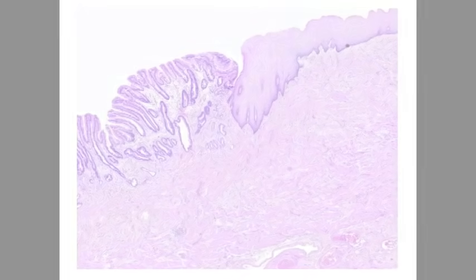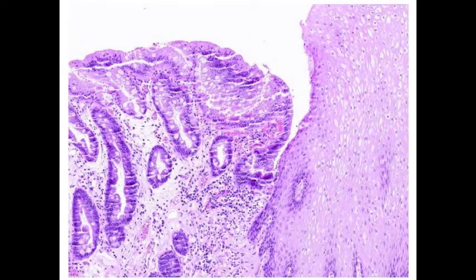Barrett's esophagus is a condition in which the stratified squamous non-keratinized epithelium of the esophagus is replaced with columnar epithelium. This video shows a typical appearance of the pathological metaplasia of a patient diagnosed with Barrett's esophagus. In the distal esophagus, the normal pearly white esophageal mucosa contrasts the salmon-colored mucosa of the Barrett's esophagus. A biopsy of this region shows the presence of columnar and goblet cells in the esophageal mucosa.